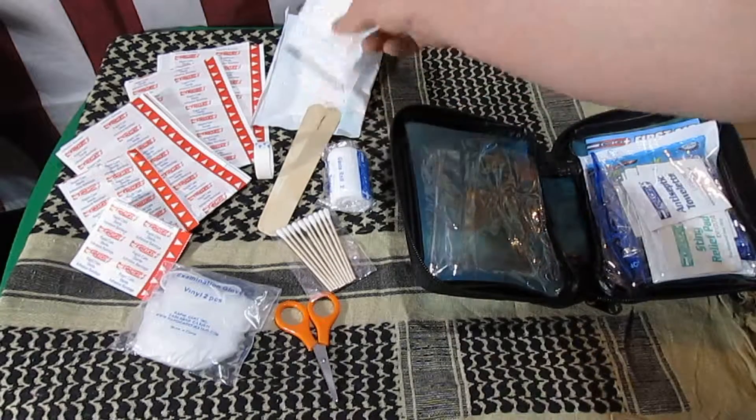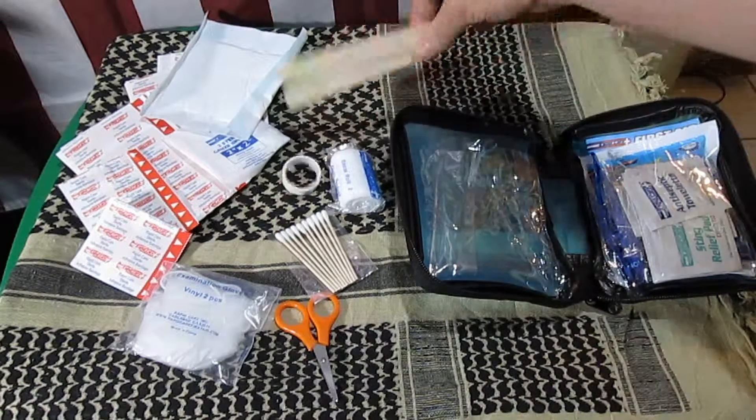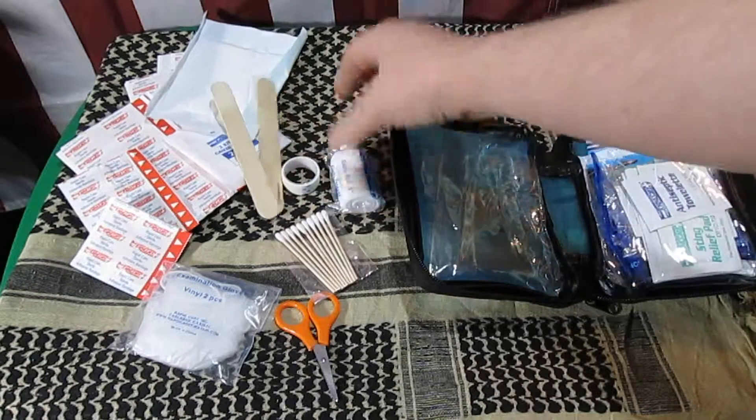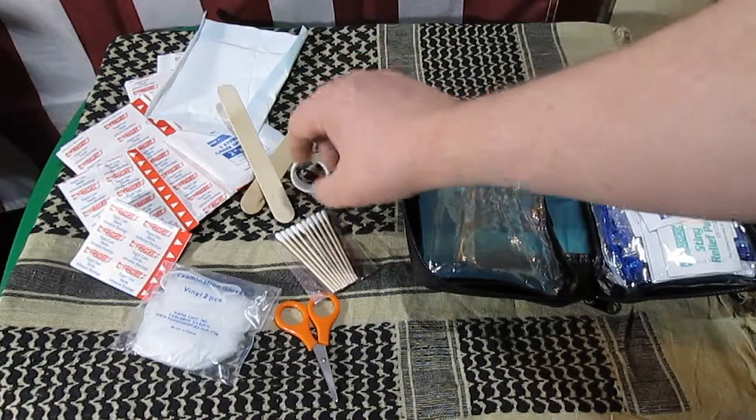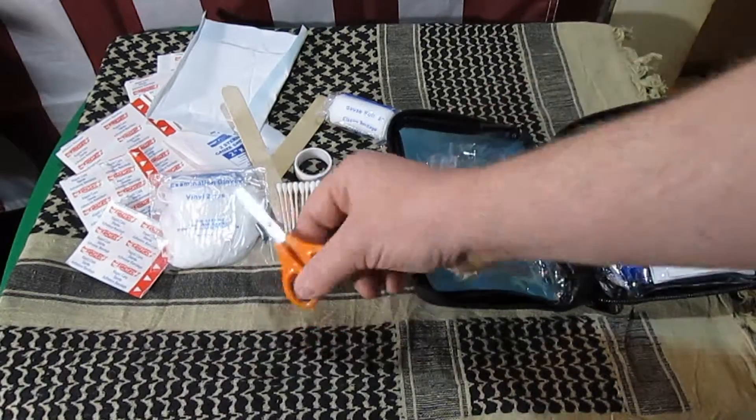You get a small roll of tape, a 2x2 and a 4x4, some finger splints, a roll of gauze, a roll of tape, cotton tip applicators, vinyl gloves, and a little pair of scissors.